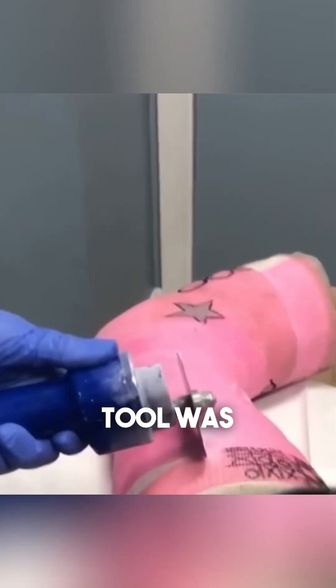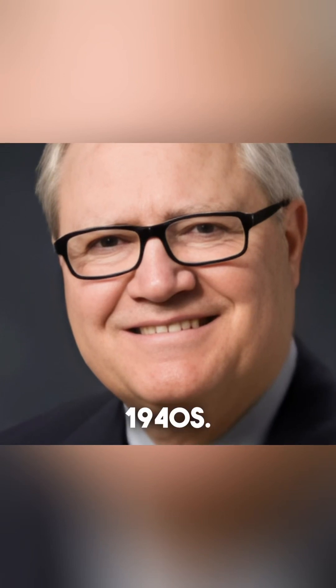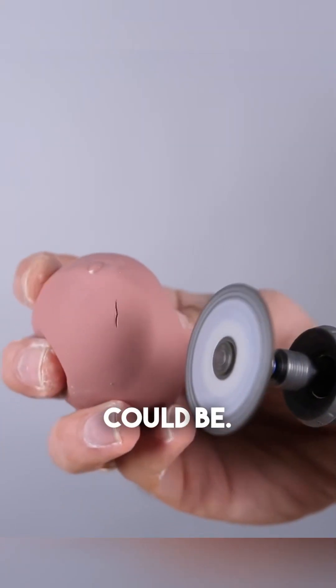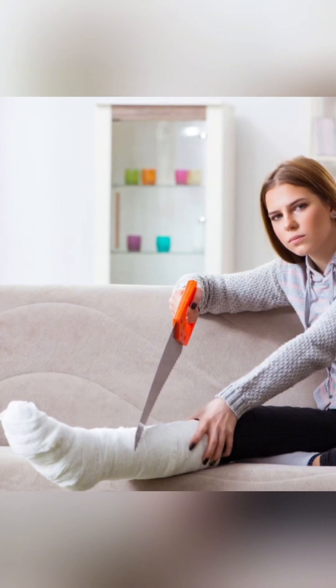This incredible tool was actually invented by Dr. John Stryker in the 1940s. He was an orthopedic surgeon who saw how dangerous and painful traditional cast removal methods could be. At the time, doctors had to use sharp tools and even hand saws.